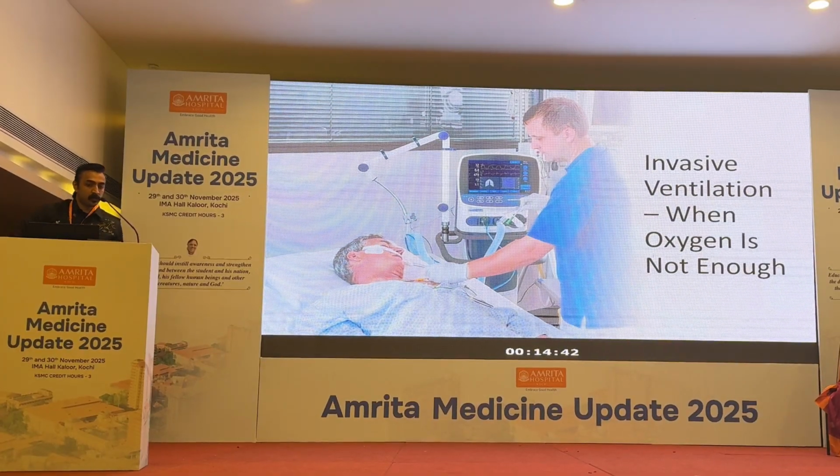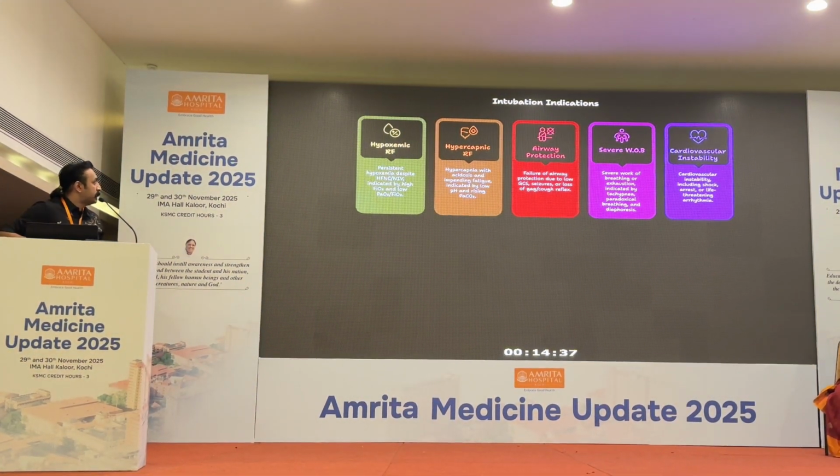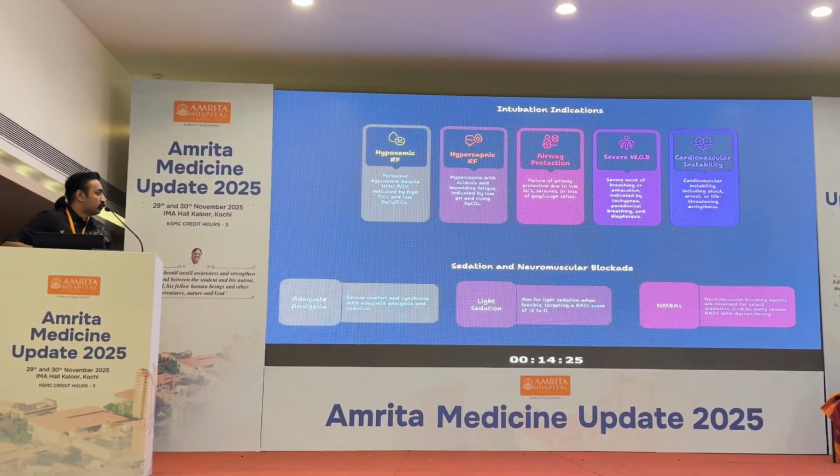Yes, we will just quickly run through the ventilation part. The usual indications for mechanical ventilation: you have the hypoxemic respiratory failure, hypercapnic respiratory failure, airway protection, severe work of breathing, and cardiovascular instability. Again, usual or traditional mechanical ventilation comes with your sedation and neuromuscular blockade.